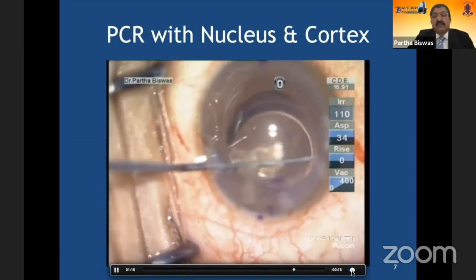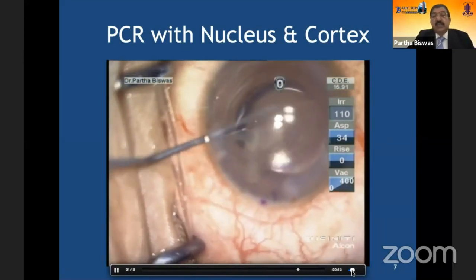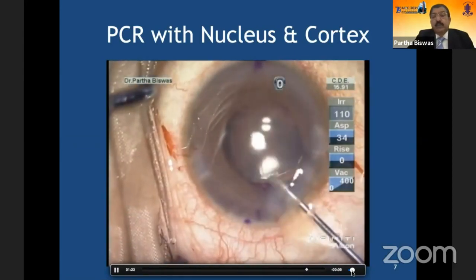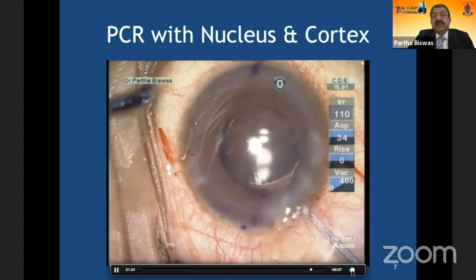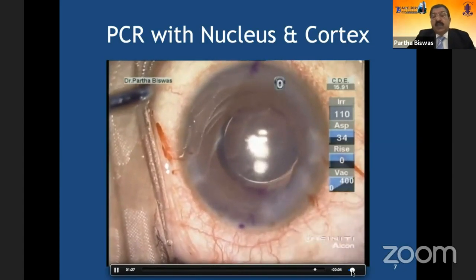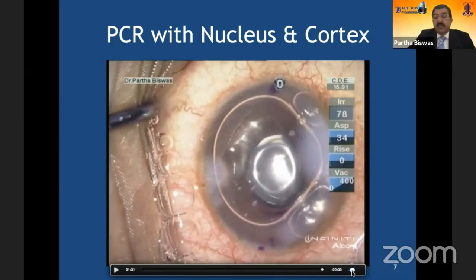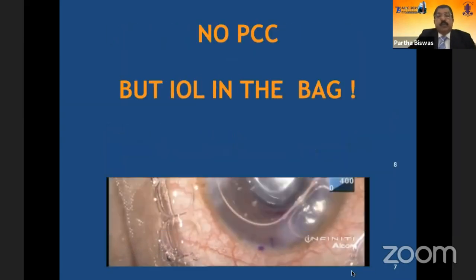However, the actual scaffolding technique is one in which a large part of the nucleus is still there. But this is just that I wanted to make sure that the lens is in place before I remove the part of the nucleus that was there. And of course, doing a vitrectomy with triamcinolone as and when required is important.